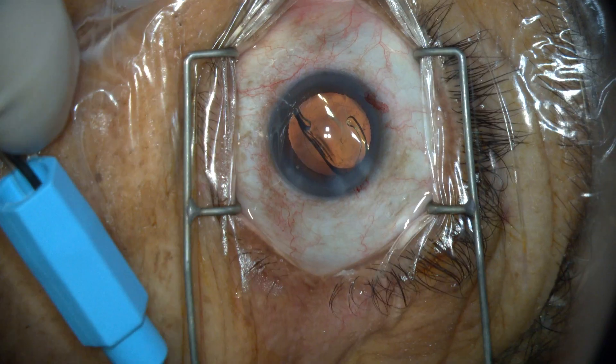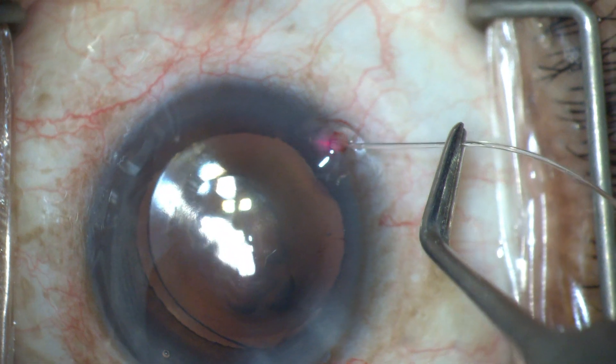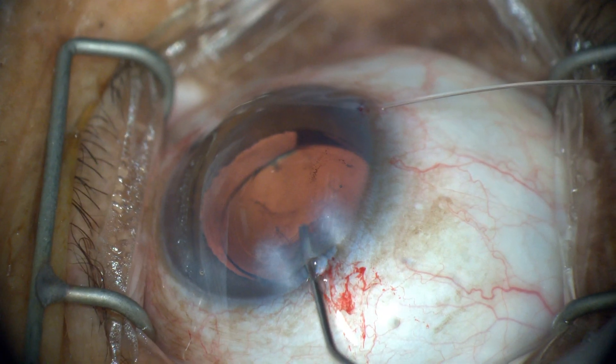A right-handed paracentesis is made. Following the cataract procedure, the blue hub is fixated to the left of the eye and the microcatheter is inserted in the anterior chamber through the paracentesis.